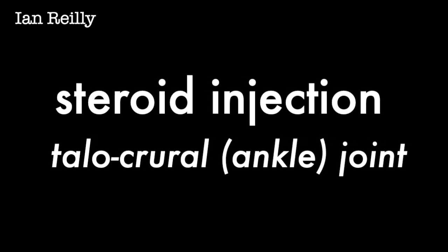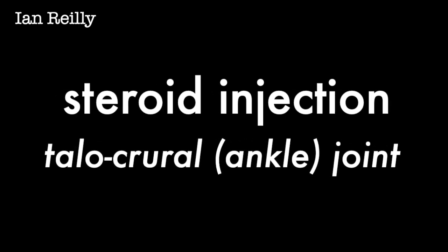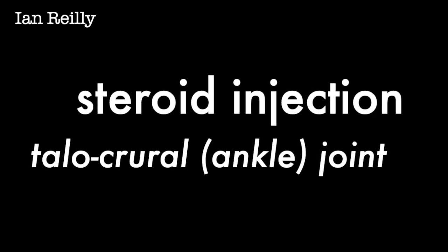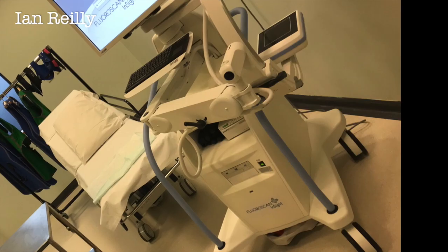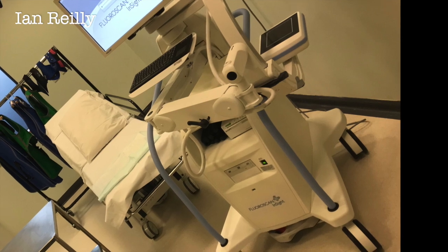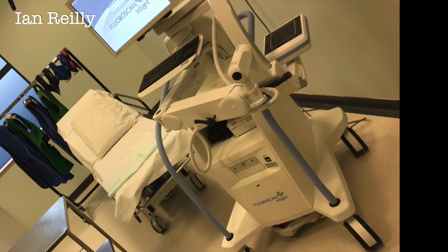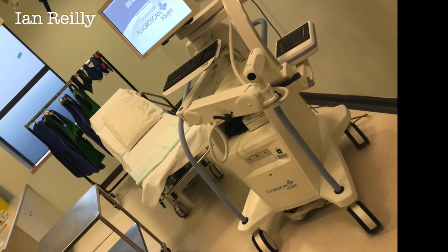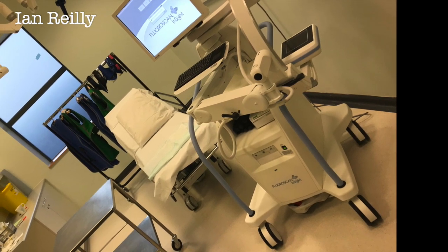Here are a pair of ankle injections done under Image Intensifier to confirm needle placement for a fairly chronic and grumbling set of ankles. This is a procedure room where I do my guided injections. Just out of shot is my ultrasound machine that I use for my soft tissue injections. On the right of the screen there's my x-ray unit, fluoroscopy.